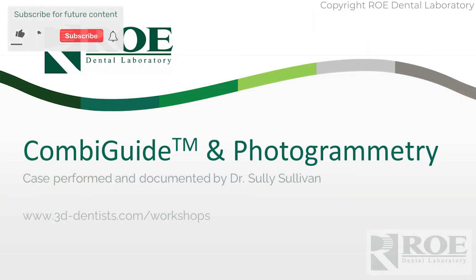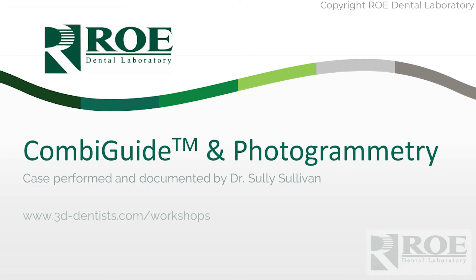This video will discuss photogrammetry combined with guided surgery. The guided surgery we're discussing is bone reduction and implant drilling and placement. This case is performed by Dr. Sully Sullivan through 3D Dentist and their training workshops. We encourage anyone interested in this combination or any kind of photogrammetry training to go through this program — they really do a wonderful job. You can see the link at the bottom of the screen. So let's go through the case.